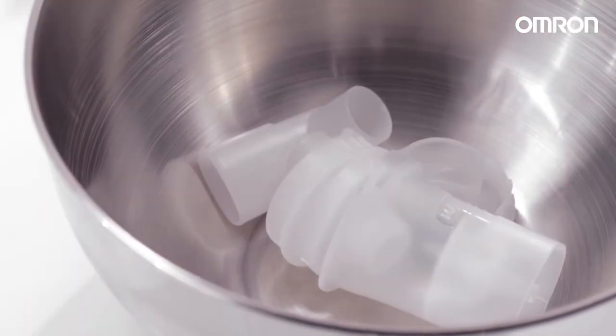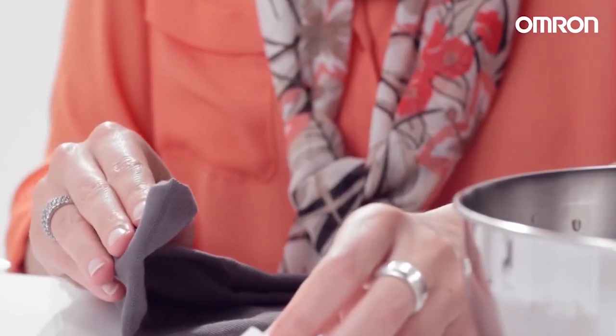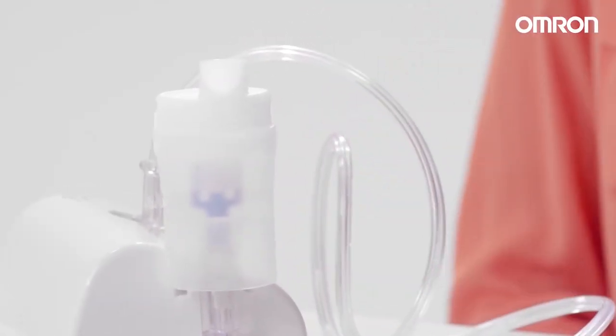Always clean the nebulizer kit and accessories by thoroughly rinsing with clean hot tap water after each use and after the last treatment of the day. Reassemble the nebulizer kit and put it in the storage bag.